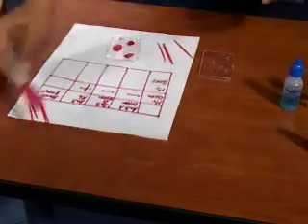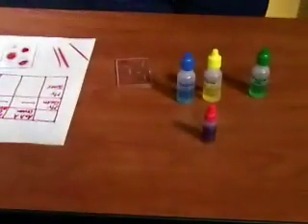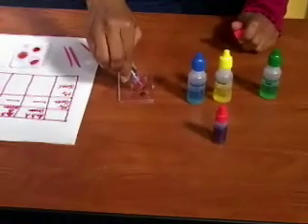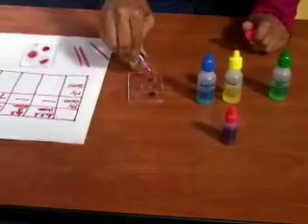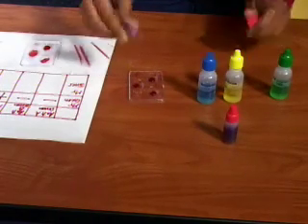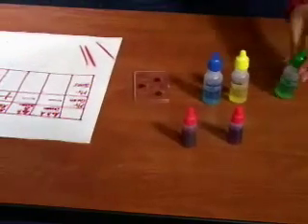Now let's do another one, and we take Mr. Jones' blood, and again do the same thing. We put 2 drops or 3. Keep this away.